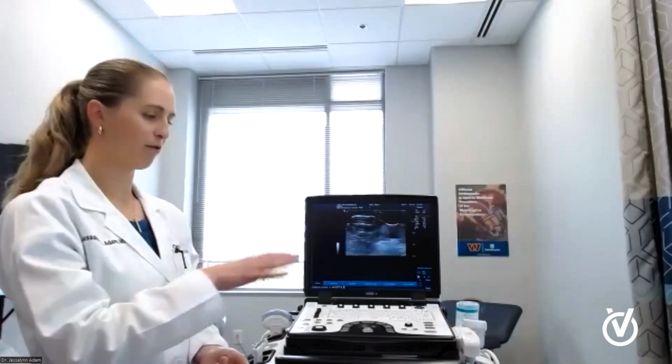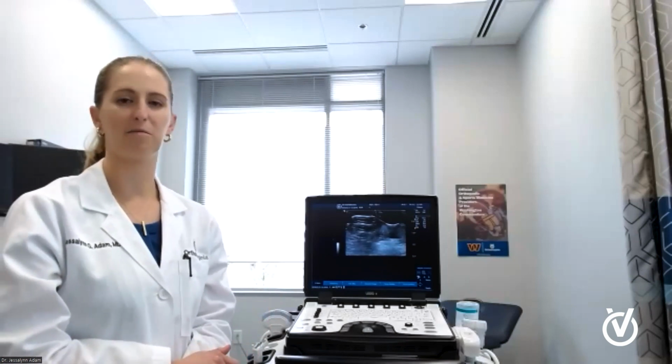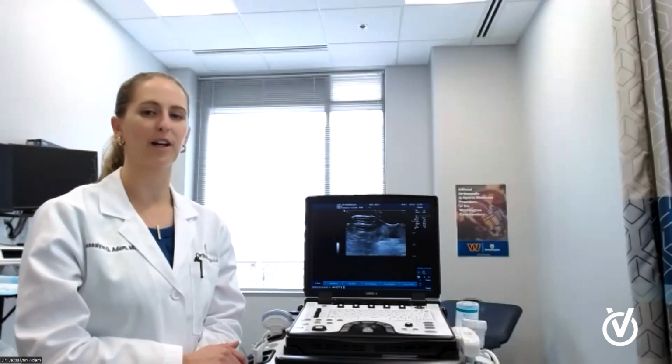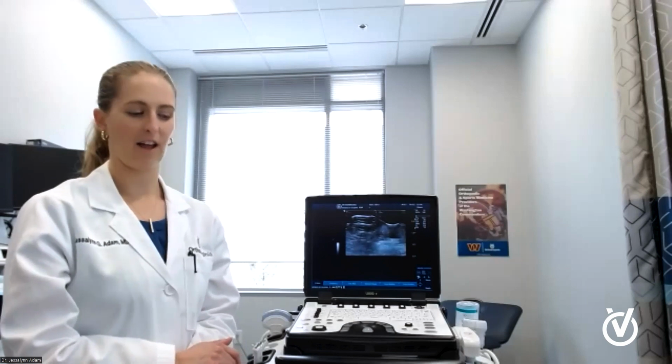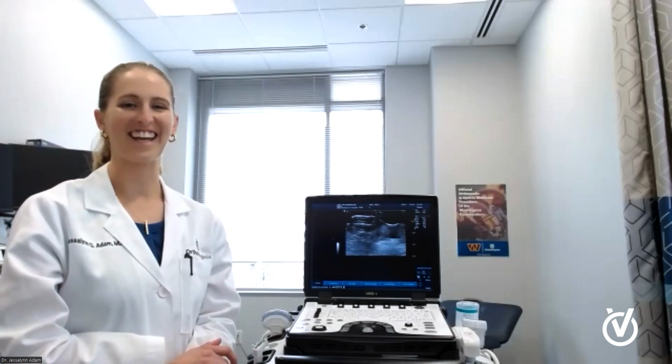Thank you. Does the ultrasound actually treat an area, or is it just diagnostic? So the type of ultrasound that I'm referring to and that I use is a diagnostic modality. It is not a therapeutic ultrasound. The only time it becomes therapeutic is when it's guiding a needle.